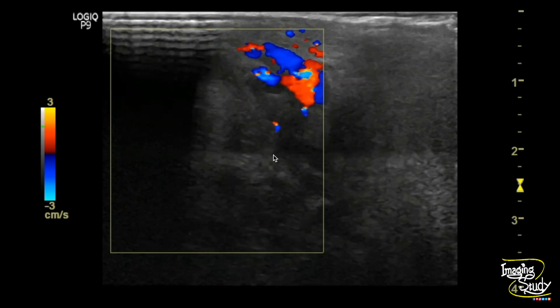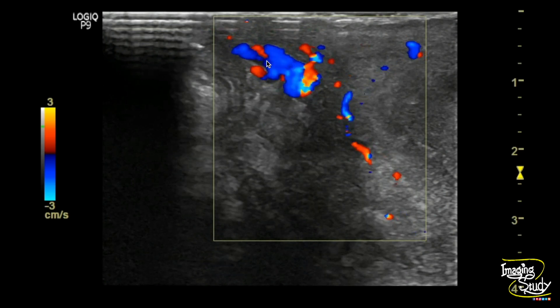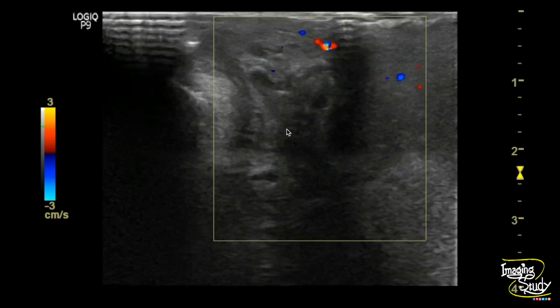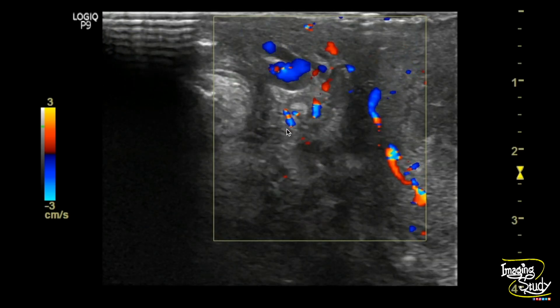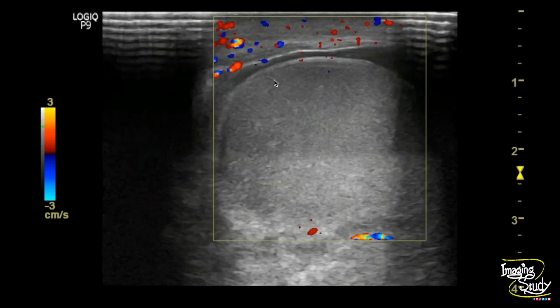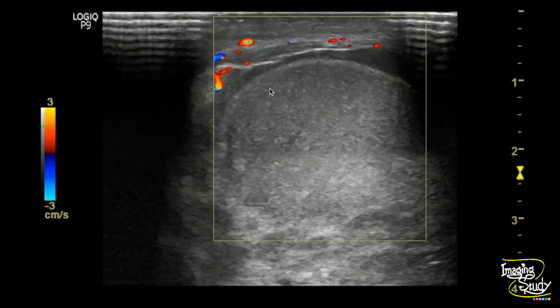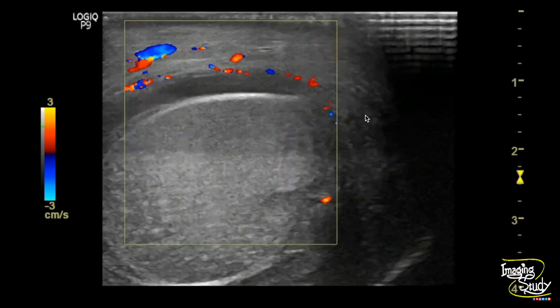Here's the area of the epididymis and you can see a good amount of blood flow here. The good amount of flow within the thickened hemiscrotal skin indicates adjacent inflammatory changes.